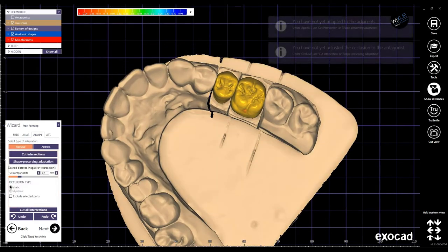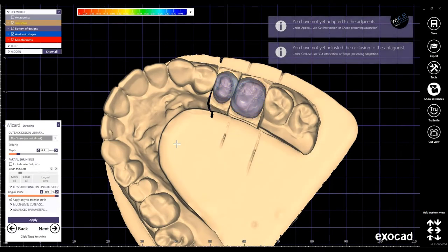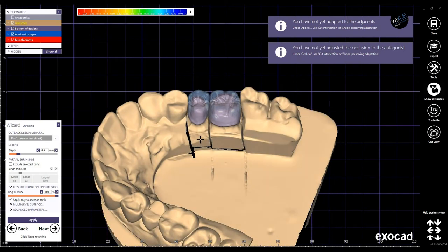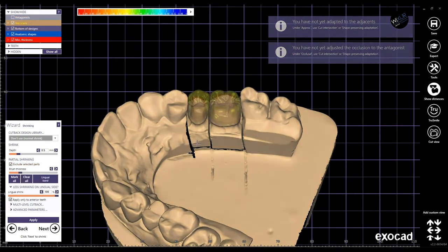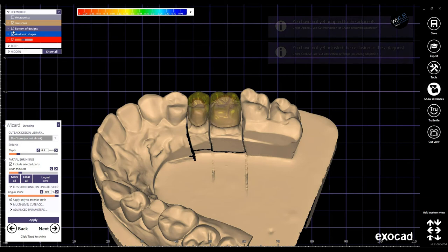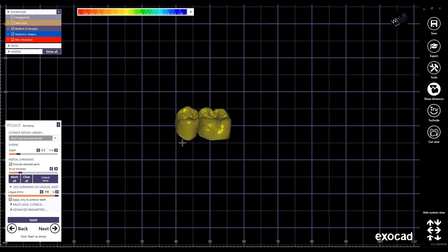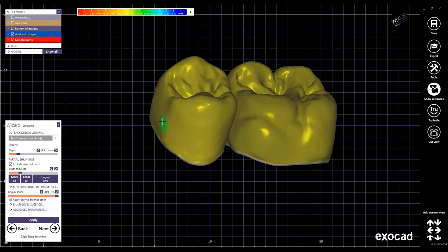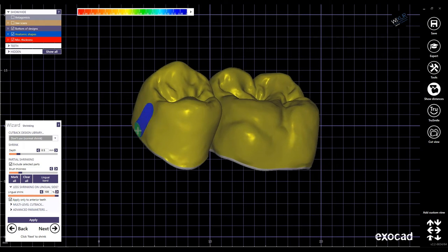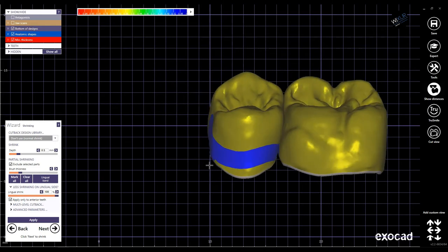Click next, and here in the shrinking window, use the 'Exclude Selected Parts' checkbox, and by marking it blue, this area will be excluded from shrinking.